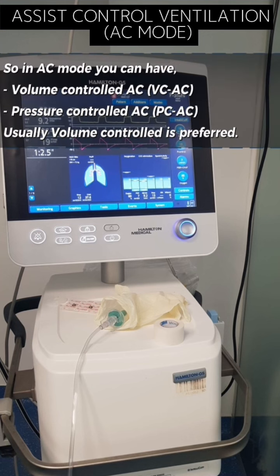As we discussed earlier, in mechanical ventilation, you can control either volume or pressure, not both at the same time. So in AC mode, you can have volume controlled AC, VCAC, and pressure controlled AC, PCAC. Usually volume controlled AC is preferred, but in some patients, we switch to pressure controlled AC.